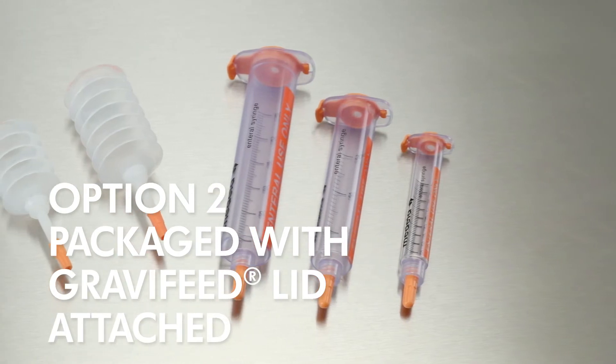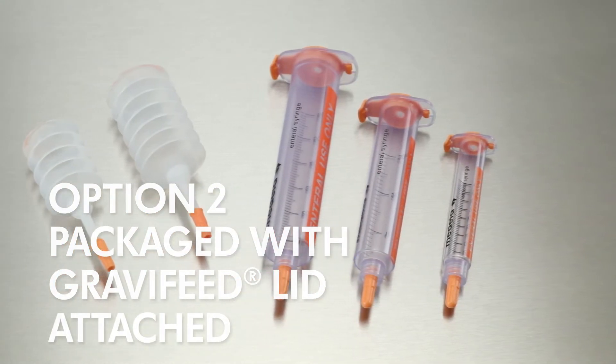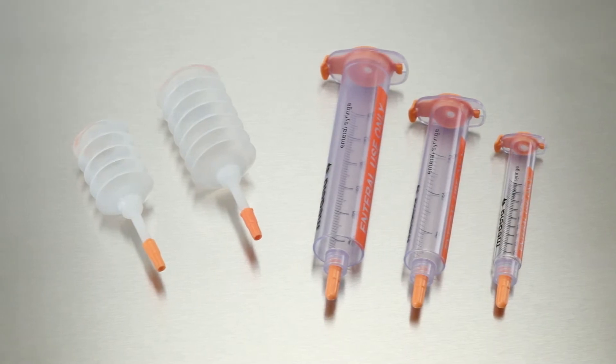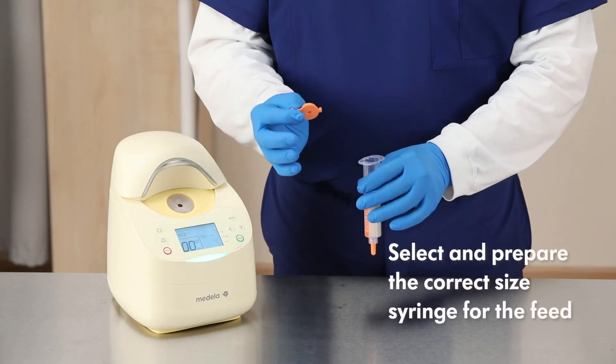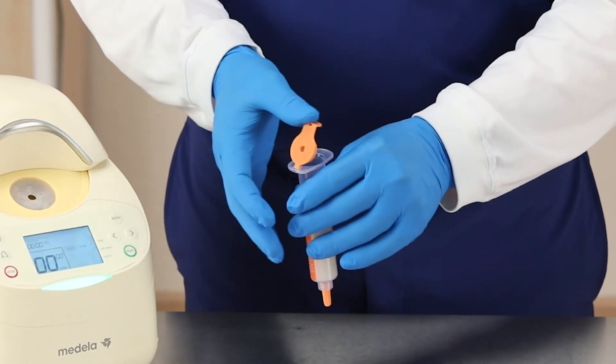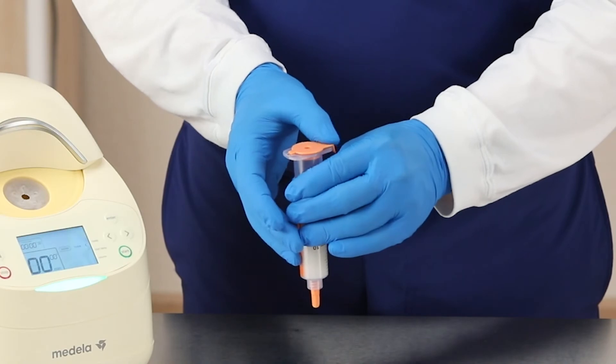Option 2. Gravifeed lids are purchased attached to the syringe. These are purchased without plungers and are often used with primers. Select and prepare the correct size syringe for the feed. Snap the Gravifeed lid closed. Secure the non-vented cap to the syringe tip.